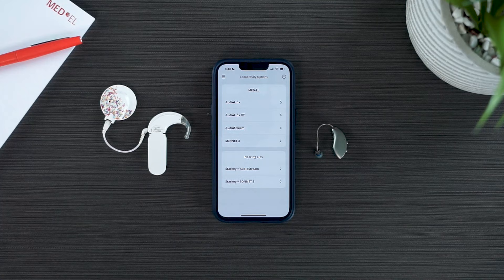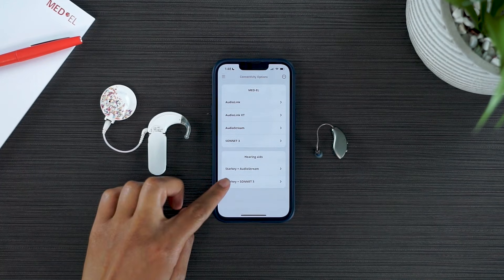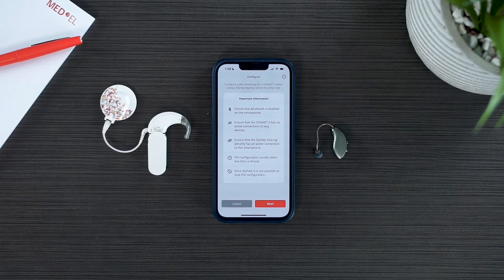If you have a Sonnet or Rondo 3 with audio stream, you can select the top option instead. Review the important information on the screen and then select Next.